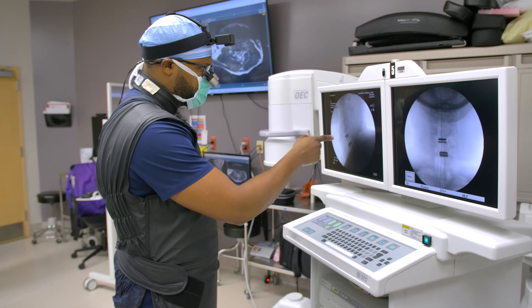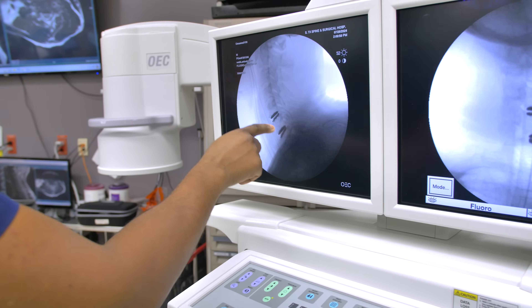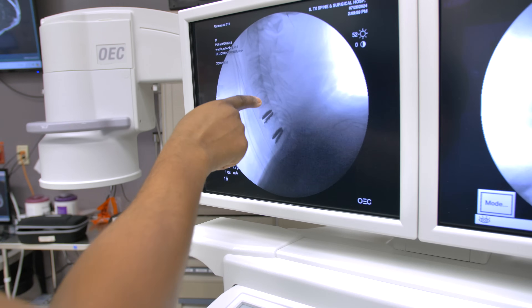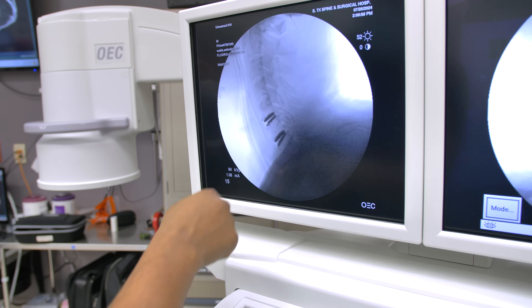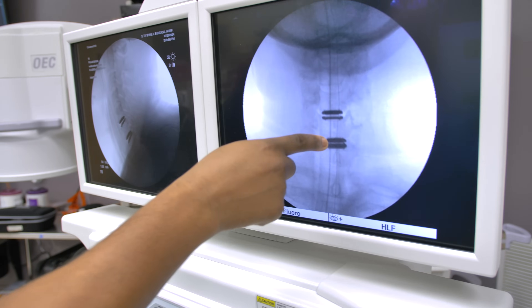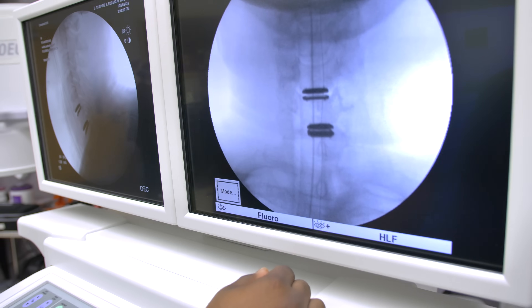This is the lateral view, looking at it from the side here. This is C2, 3, 4, 5, 6, 7. We replaced the cushions and took the pressure off his spinal cord at these two levels here. This is what it looks like from the A to P — the disc placement, right down the center here.